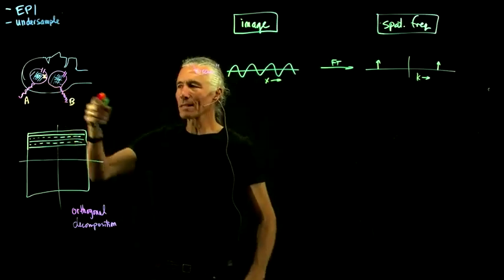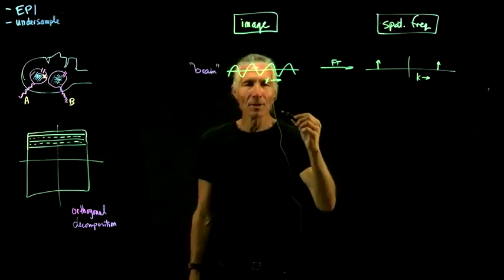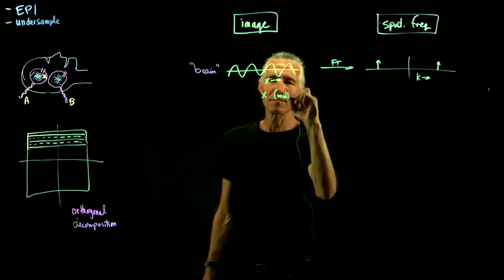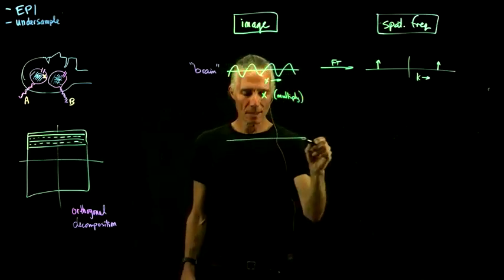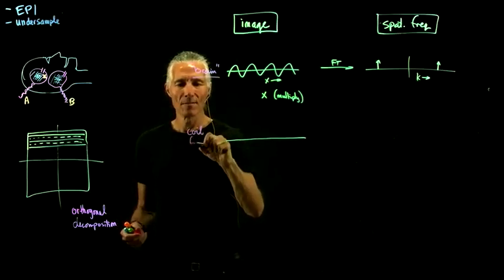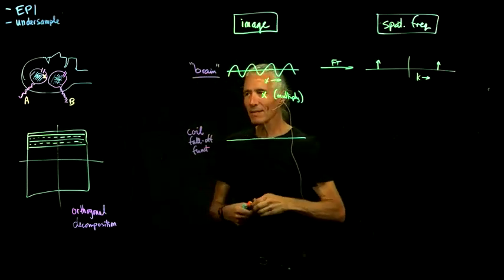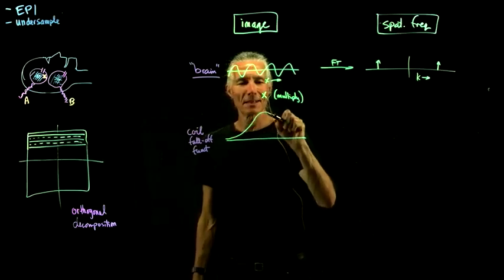So now what happens when we have a coil like this? If you have a coil like this, that's actually multiplying, not adding. So multiply that by the coil fall-off function. So here's our brain, here's our coil fall-off function. And so what does that look like? Well, it doesn't look exactly like a Gaussian, but let's just say it sort of looks like a Gaussian.